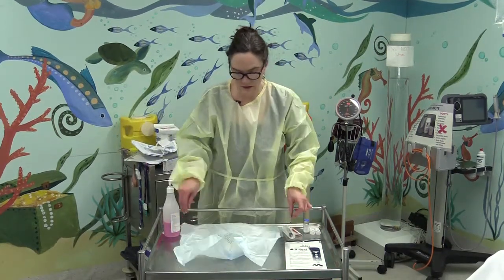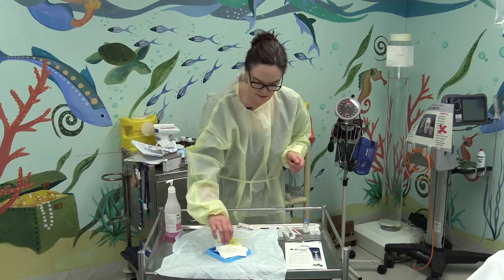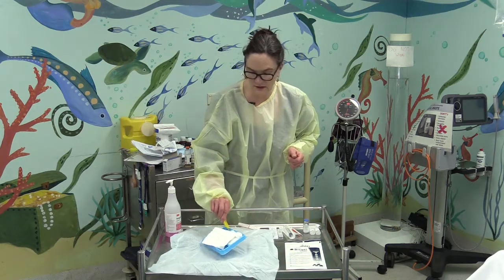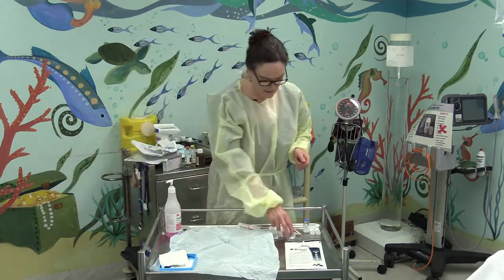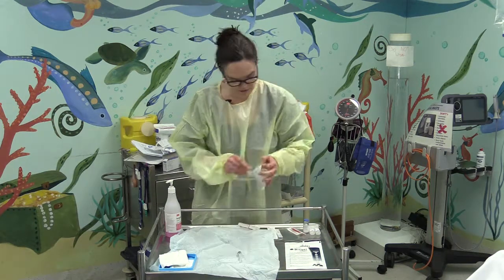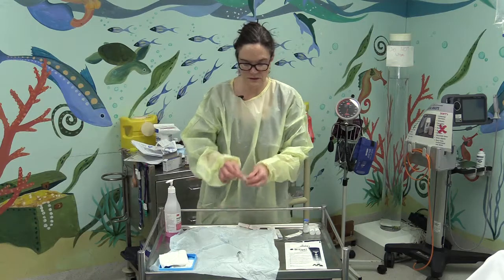Open up my equipment. Don't actually need any of that. I'm really just using the towel underneath. My syringe for my cefazolin and needles.